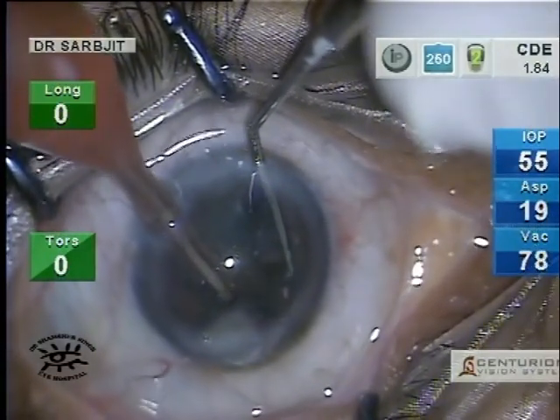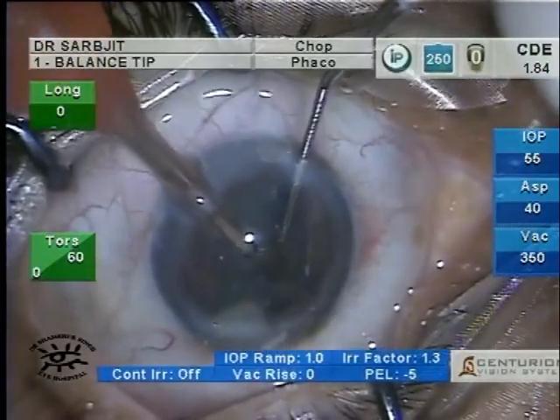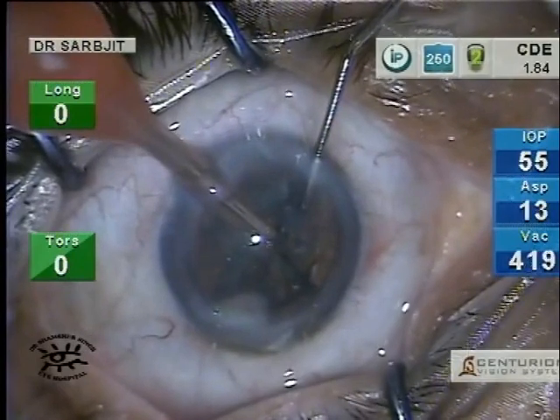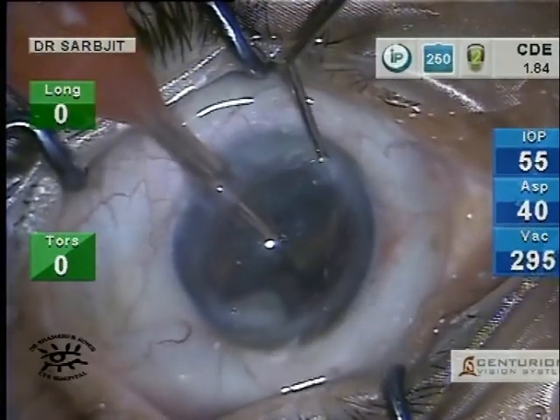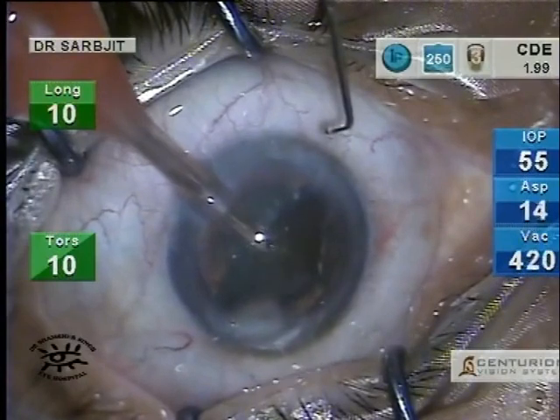Once I'm happy with the number of fragments that I've made, I shall change my settings to quadrant removal, where the vacuum is set to 600 and the aspiration is set to 40. The chopper goes out and the one-handed phacoemulsification starts.